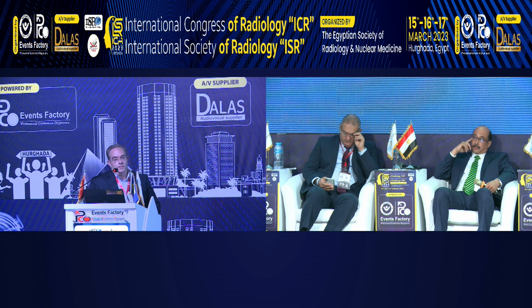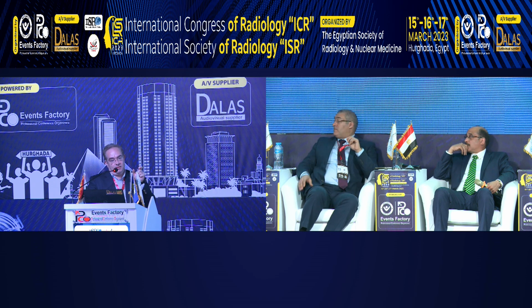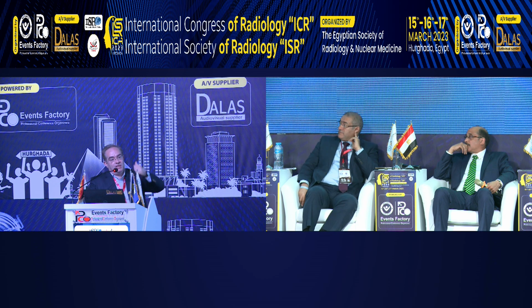How could we avoid this? The last case we did, yes, the last one, actually the smallest one, we punctured the nodule with the trocar. We inserted the needle and opened it for just 1 centimeter, not to bypass. Actually I bypassed the nodule with the puncture point of the needle, but the cutting portion was completely inside, and the remaining part of the cutting portion was inside the trocar. So I just cut a small part of the nodule while the remaining part was fixed, anchored with the trocar.